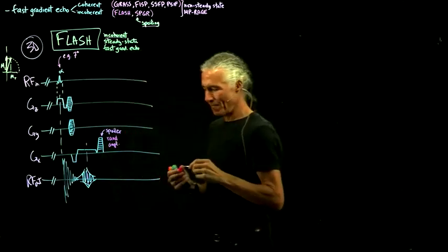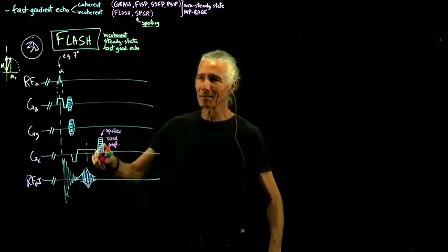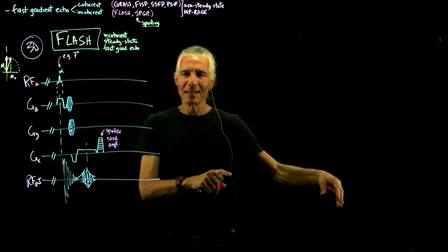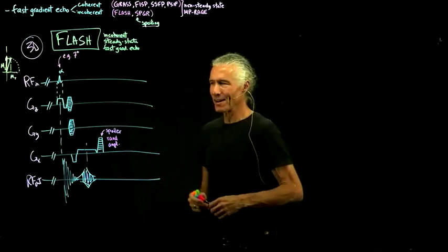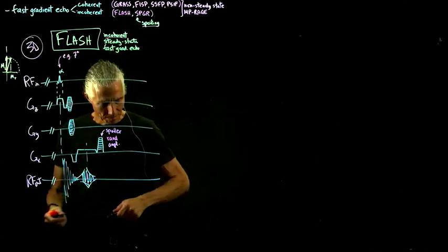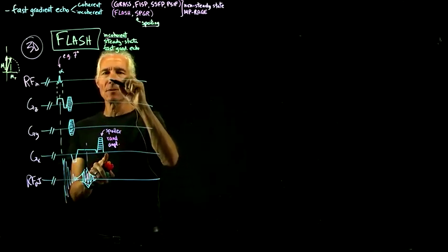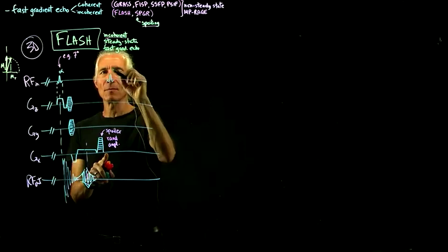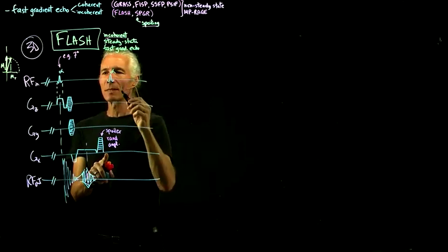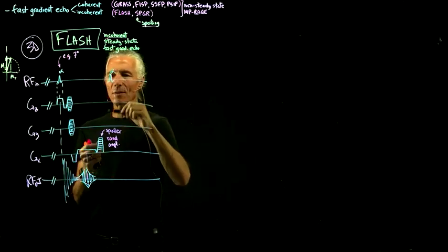To just kind of mess it up. So just sometimes mess it up a lot, sometimes mess it up less, and that just gets it out of there, just gets it out of your hair. And so then what you can do is, at this point, you can just do another RF pulse, another alpha pulse, assuming that you kind of wiped out any magnetization that was still there.